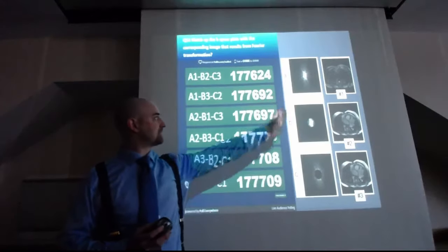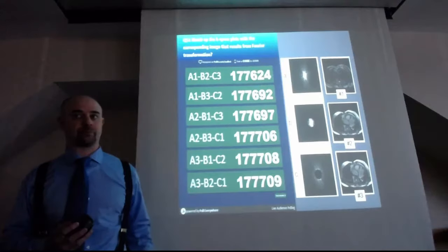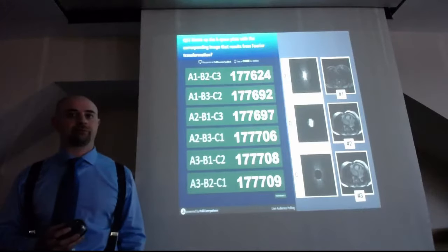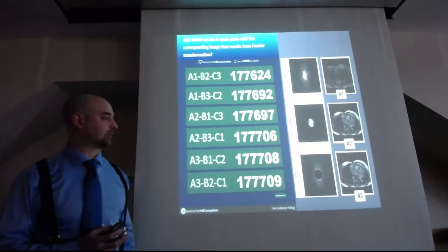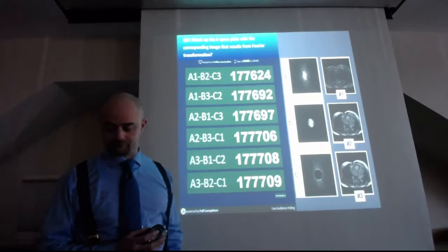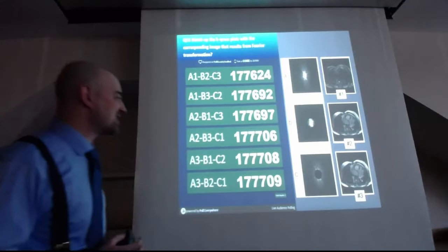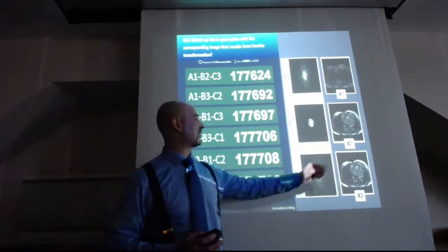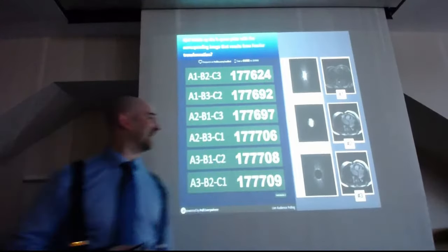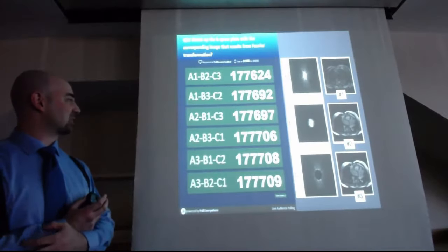Now match up the K-space pictures with the images that they would produce. So this is like our airplane picture, but with something a little more clinically relevant, a slice through the lower chest here. At least from back here, 2 and 3. Yeah, it's not projecting well. Thank you for pointing out. 2 is much blurrier than 3. Yeah, that doesn't project well at all. Sorry about that.